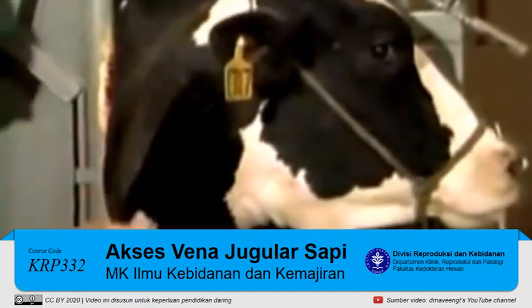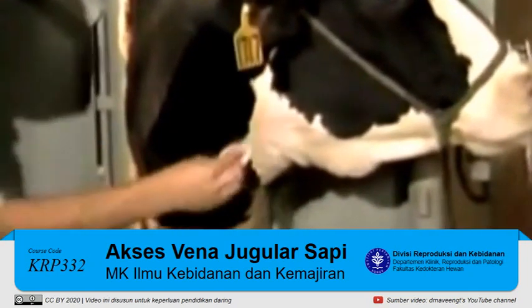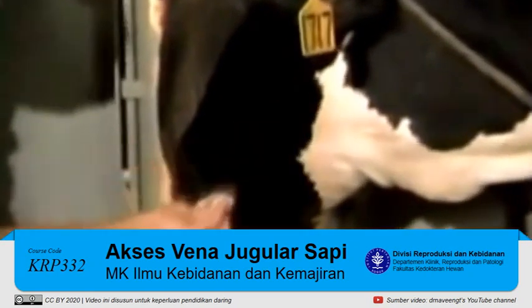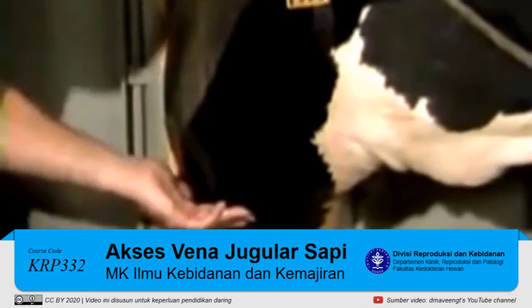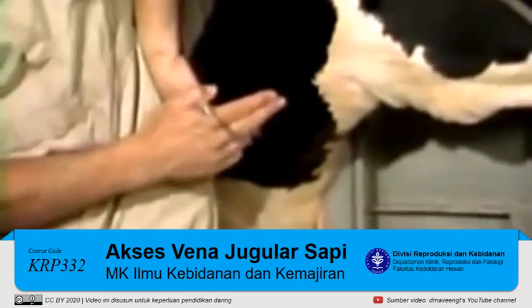Next thing we want to do is just clean the area slightly and then the immediate area right over the vein. We want to get prepared so it looks good for obtaining a blood sample from the jugular.